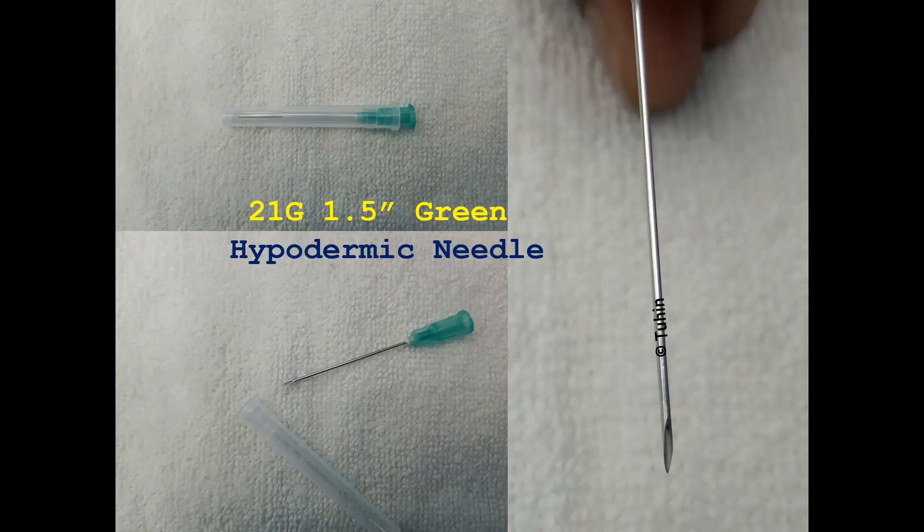The tip of a hypodermic needle is sharp beveled. Hence, it can be used as a LOR needle only after modification. There are many ways in which we can blunt a hypodermic needle tip.